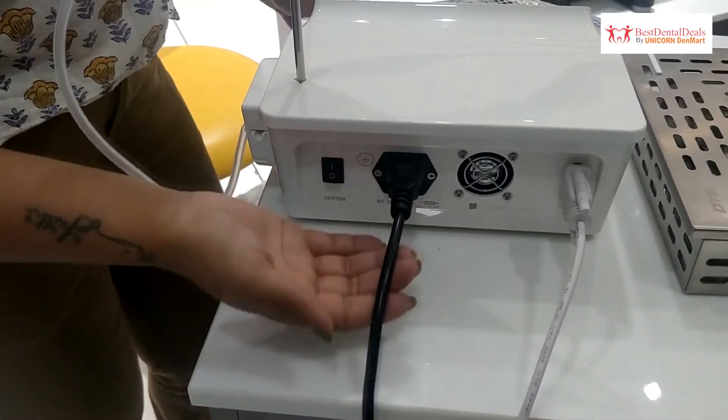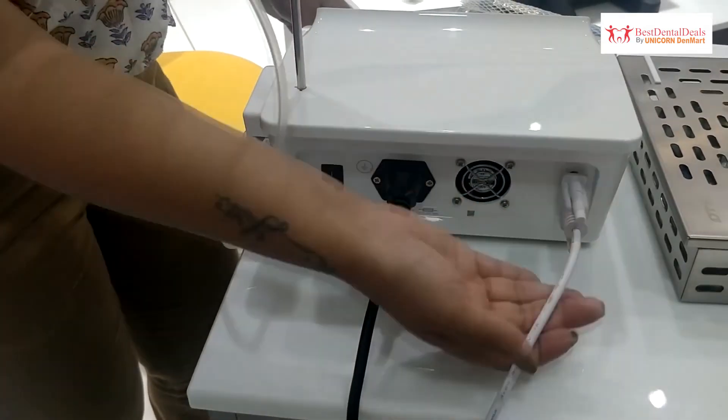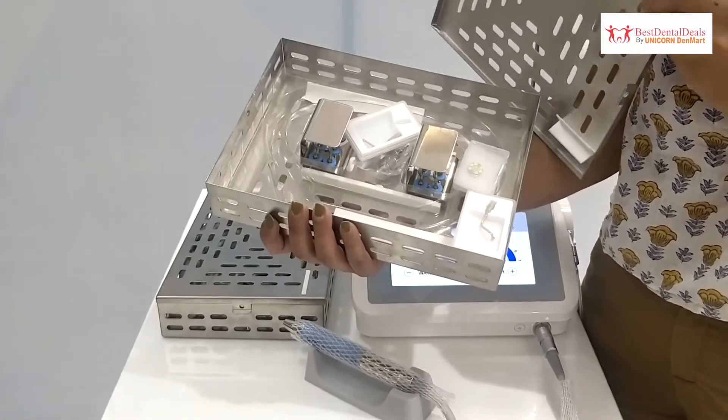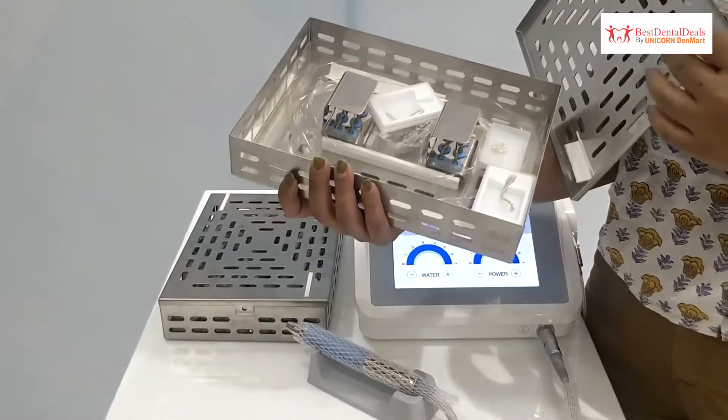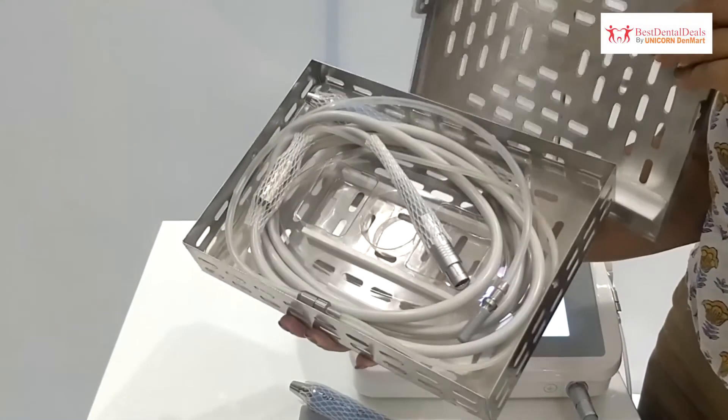The machine has two ports: one for attachment of the power cord and another for the foot control. Surgery X has two sterilization cassettes — one available with the LED handpiece and 14 tips, and another cassette with the second LED handpiece.